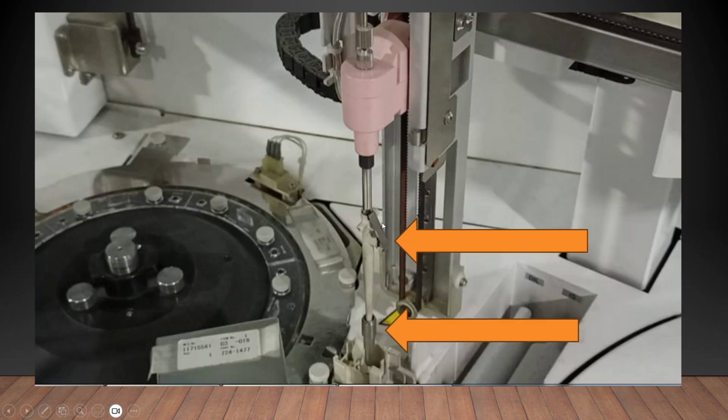Okay, and once you close the door and you give the end, immediately the instrument will pick up the piercer. Now the piercer, depending upon the instrument, there can be problems with it. As you can see, this is the piercing part of the instrument, and this is the holder part, and this is our reagent probe. Many times, there is a spring action here. If the spring action doesn't work, it will give a red alarm and stop.